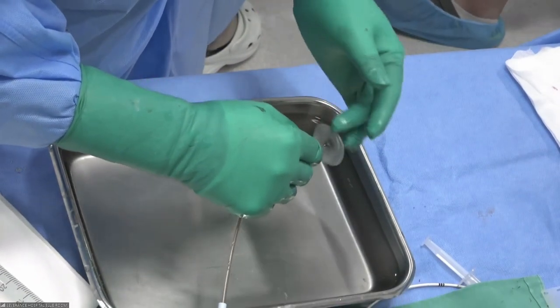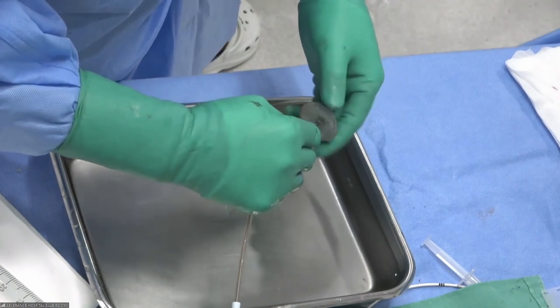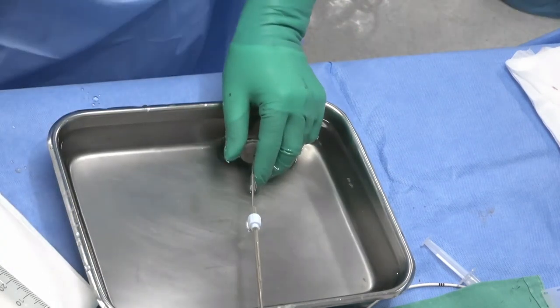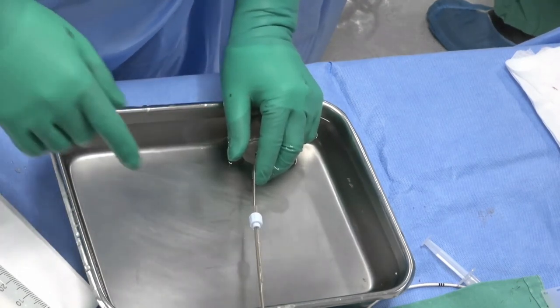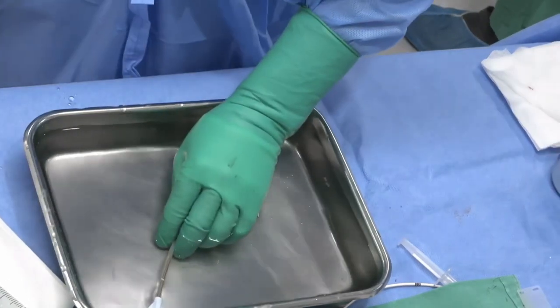So Jay, let us know the size again. 24 millimeter. 24. We confirmed it with three methods: echo measurement, the angio measurement, and the sizing balloon method.